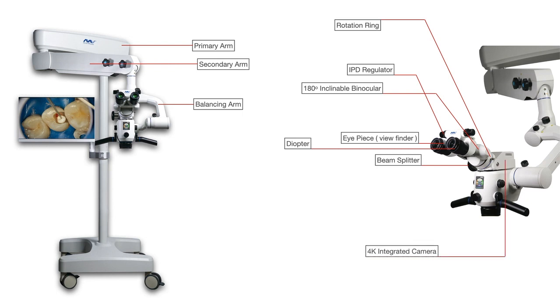So here we have an integrated camera. As I say again, it is very important to use this one because it is integrated, no space, slim and easy to control. Here we have a zooming knob in this microscope. This is my microscope. I am using a continuous one, not the step one. The first microscope that I used at that time had a step one. Some people prefer the step one, but continuous is much more advanced.